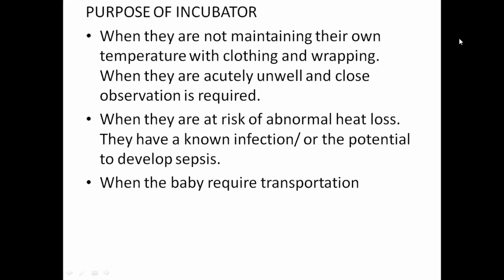Purpose of incubator. When babies are not maintaining their own temperature with clothing and wrapping, when they are acutely unwell and close observation is required, when they are at risk of abnormal heat loss, when they have infection or potential to develop sepsis, when the baby requires transportation.